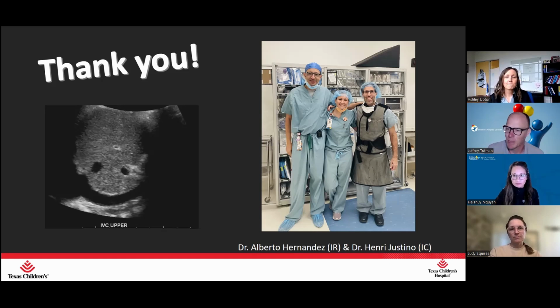Okay. One other question I had was about color versus spectral Doppler. I know doing a full Doppler study with spectral is a significant time add-on and also a significant cost. So I'm curious what your thoughts are on when we get an order for the indication just as portal vein thrombus or something. Our sonographers are always asking, could we just do color just to prove it's patent? The spectral I think definitely adds nuance to some of those things. But I'm curious what your thoughts are on when it's okay to just do color versus when you should do that full spectral study.